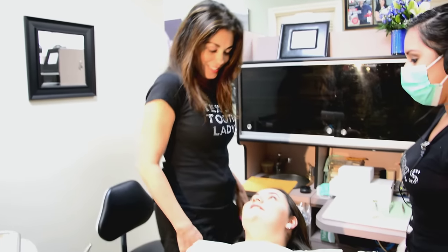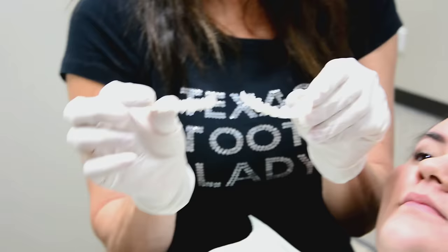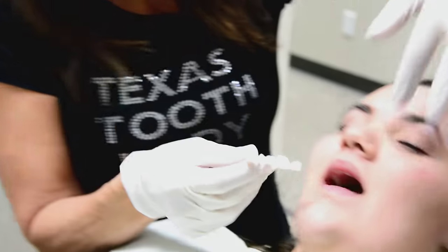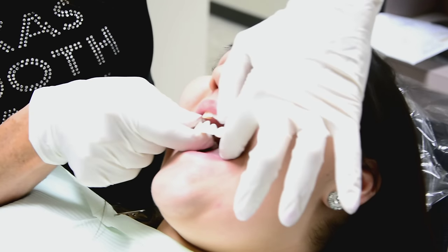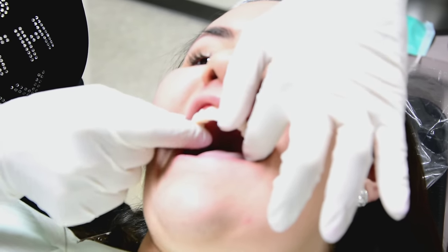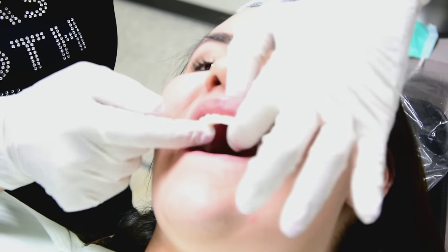This is my favorite appointment — it's when the patient receives their snap-on smile, and it is rewarding for the entire staff and for me. So let's go ahead and take a look. This is the upper appliance and this is the lower appliance. We're going to try them in — you seat them from one side to the other. We try the left side in first and then place it over the right, and it should fit nice and snug.